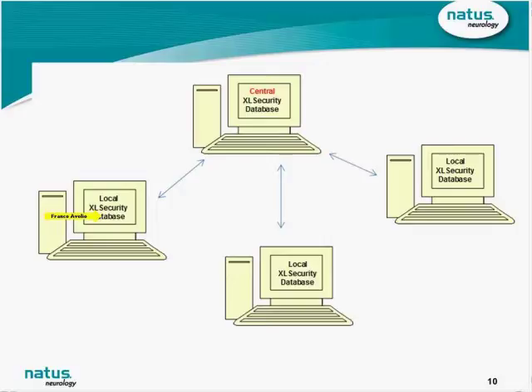It's not something that is set up to constantly run in the background every 5 minutes. Once you log on to a session, it will abide by the rules that it has in its database at the time that you initially logged in.